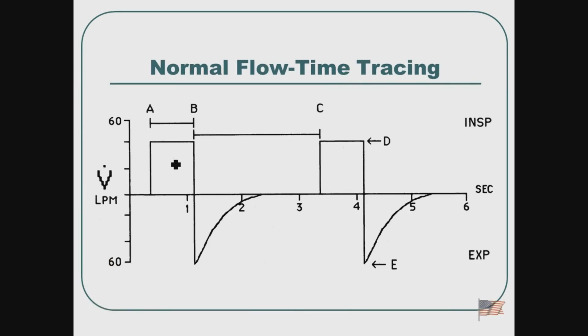So we have an inspiratory phase. We have an expiratory phase where I have an expiratory flow and an expiratory pause. So at some point as you're exhaling, you reach the 0 point and you're just waiting for the start of the next inspiratory breath. Does that make sense?